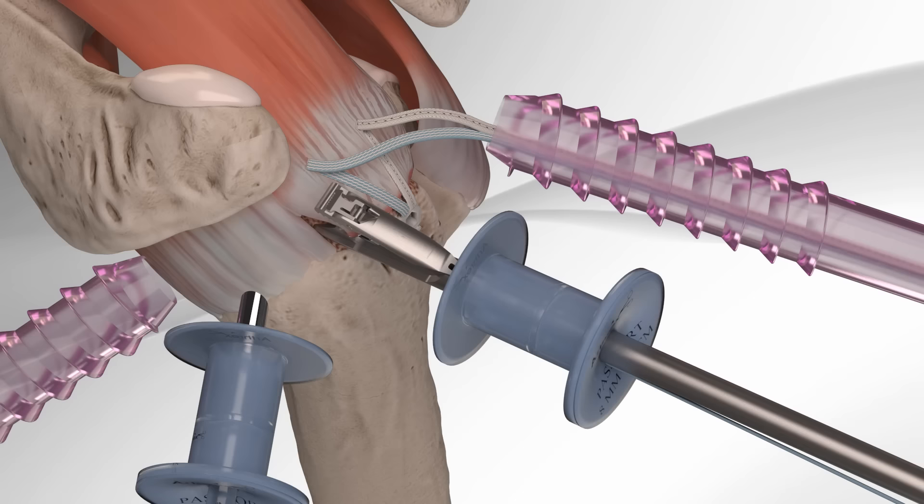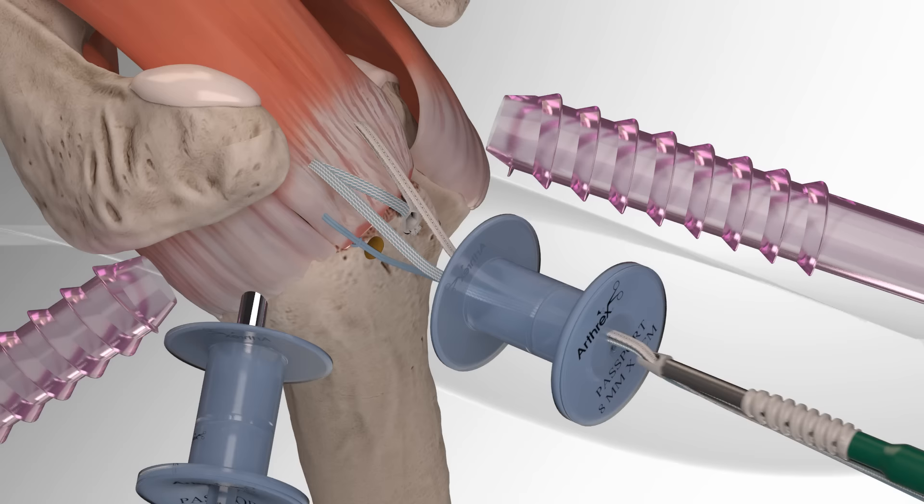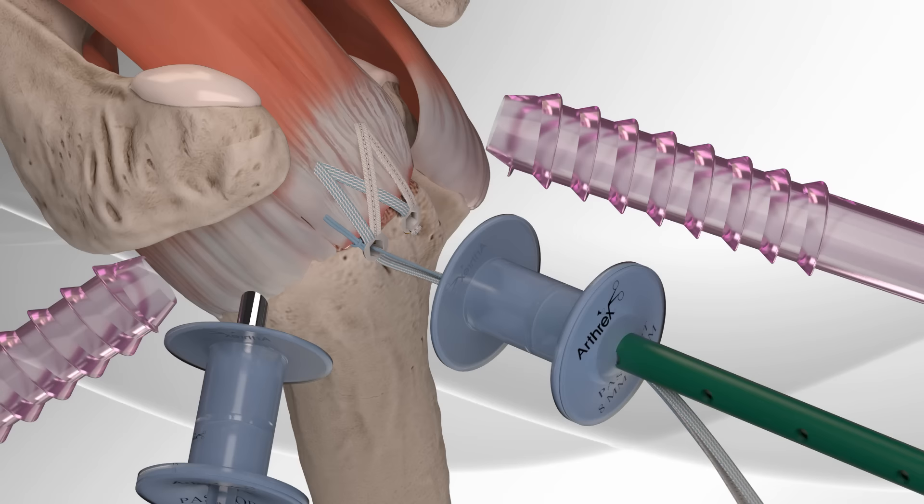Finally, if there is a loose end of rotator cuff, it can be secured with a fiber link and the two remaining fiber tape tails with a fourth and final swivel lock anchor. This completes the Speedbridge repair.